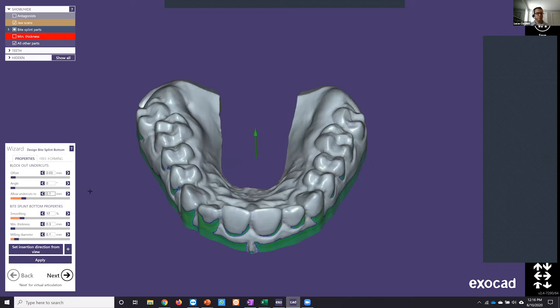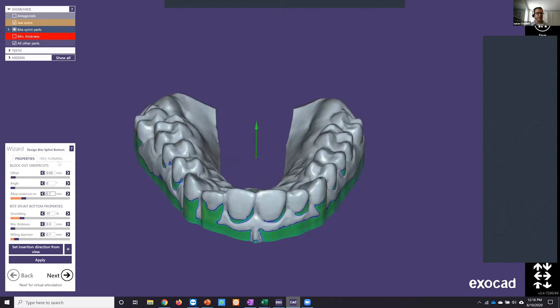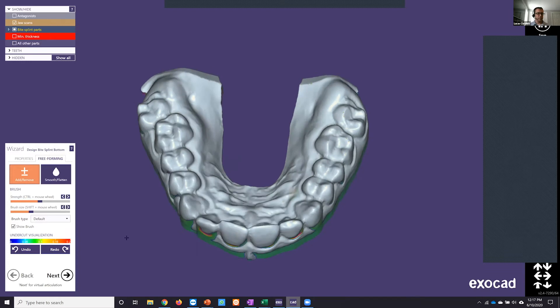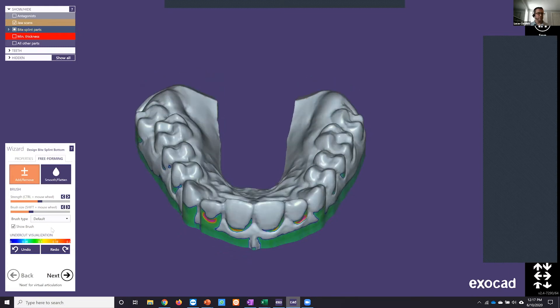What we're seeing on screen now is where the software virtually blocks out undercuts, shown with color mapping. Another great tool at this step is the freeforming tab — we can go in and customize that block-out using wax knife tools, as indicated by the color map. This lets you further customize and enhance fits if you need a more active snap-on fit. The color chart in the lower left corner indicates how much undercut depth we have.